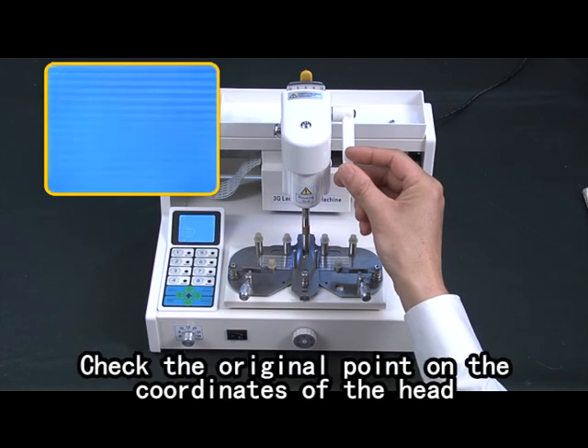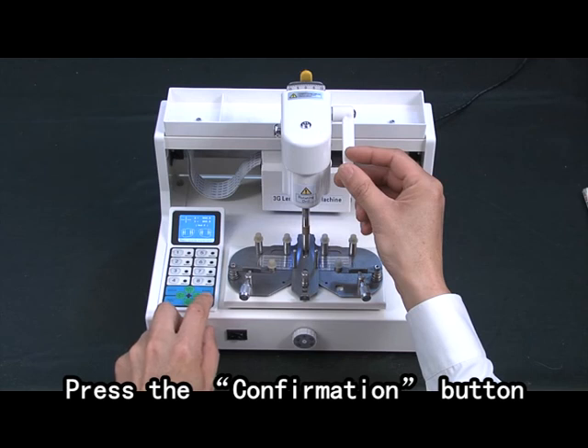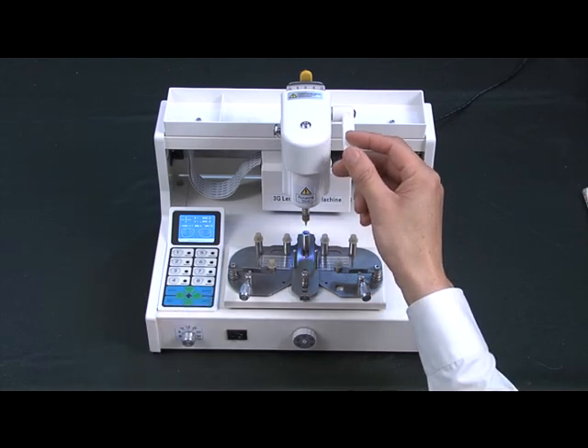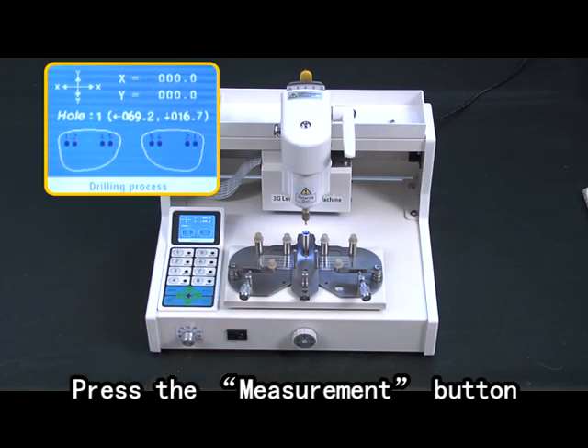Check the original point on the coordinates of the head. Press the confirmation button. Arrange the pattern measurement. The drilling lenses need to be exactly the same size as the pattern ones. Press the measurement button.